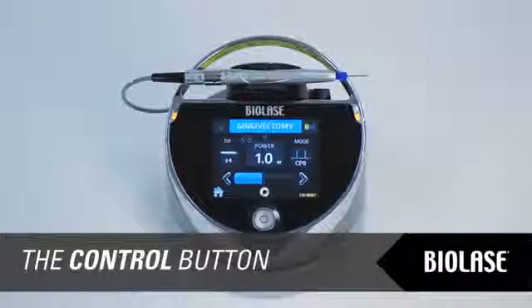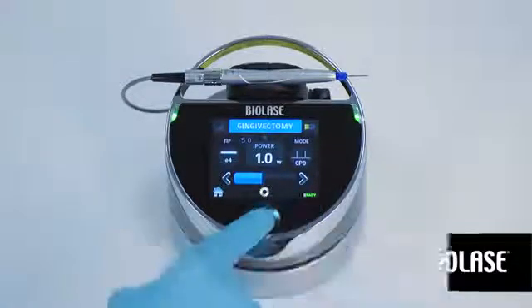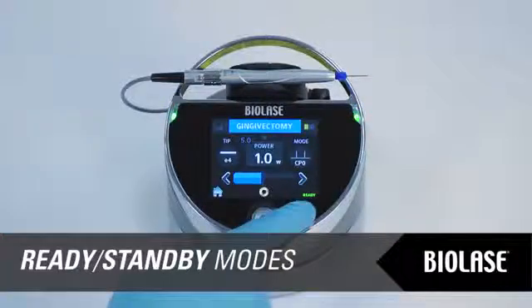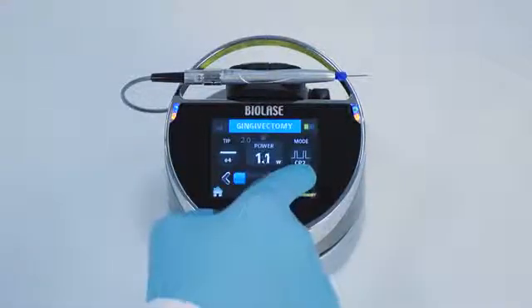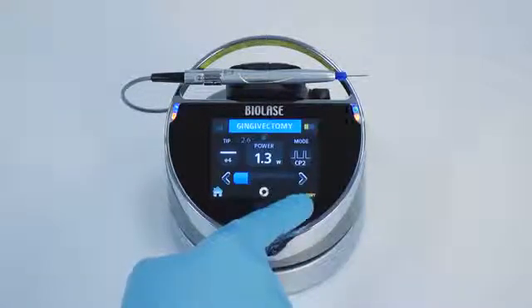The control button on the EPIC is a multi-function button. Pressing and holding the control button for two seconds will allow you to transition the laser from standby mode to ready mode. Note that you will not be able to place the EPIC in ready mode unless you have selected a treatment mode on the home screen first. Press and release the control button to place the EPIC laser into either ready or standby mode. The laser console will only emit laser energy when the foot switch is pressed and the laser console is set to ready mode. While in ready or standby mode, you may change modes, power settings, and other variables only when the foot switch is not engaged and the laser is not firing. Adjusting any settings is blocked when the laser is firing. Ready or standby is displayed in the lower right-hand corner of the display screen.